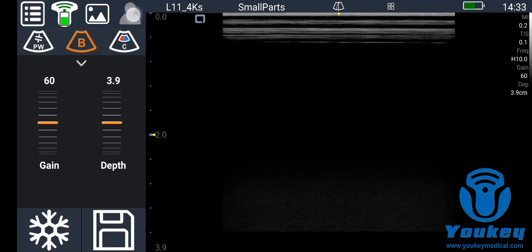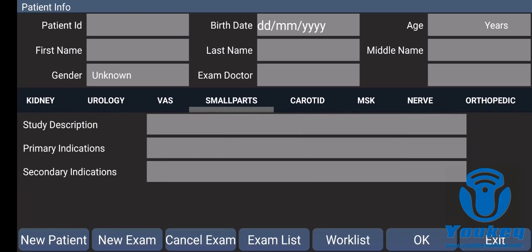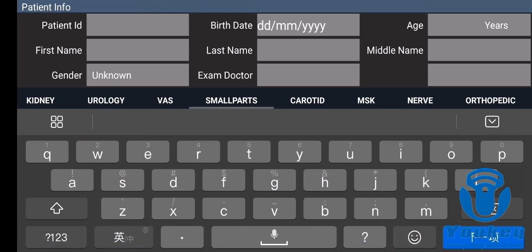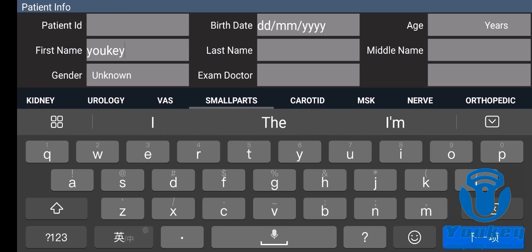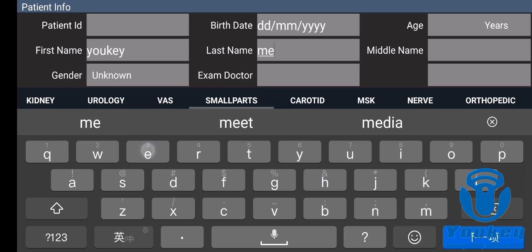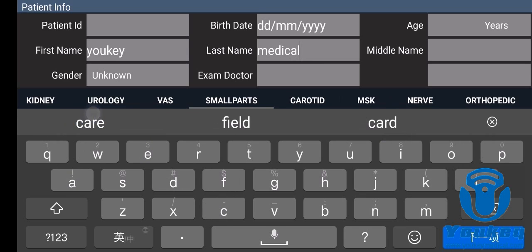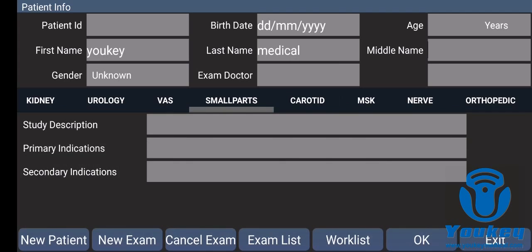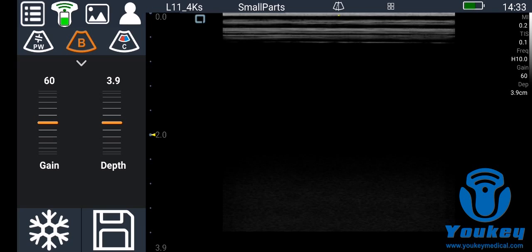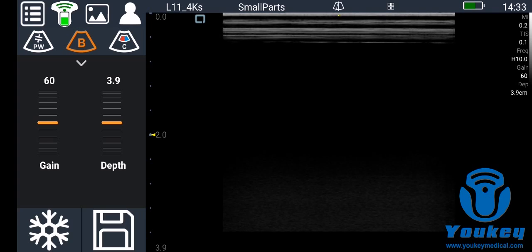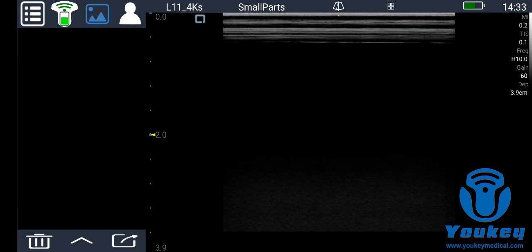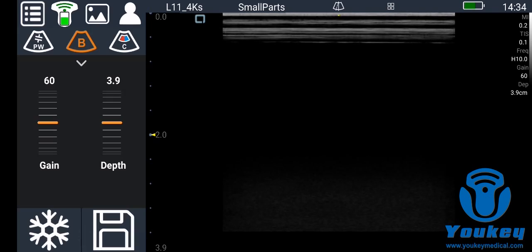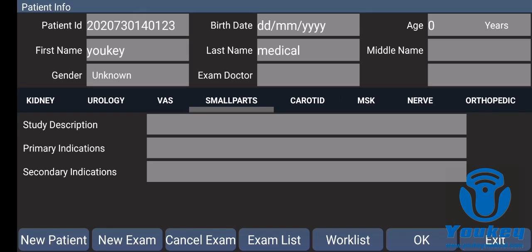You get the images, then you click the patient information icon and input the patient details and click OK. Then you will get a patient in here and the images will be clear.